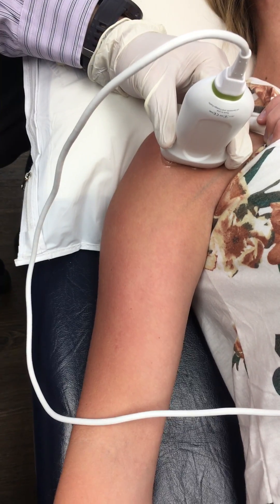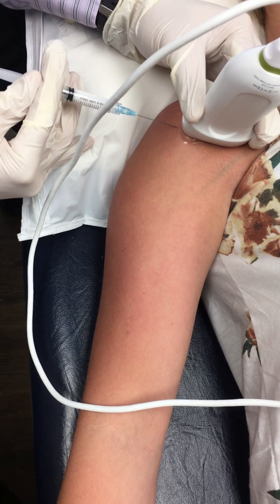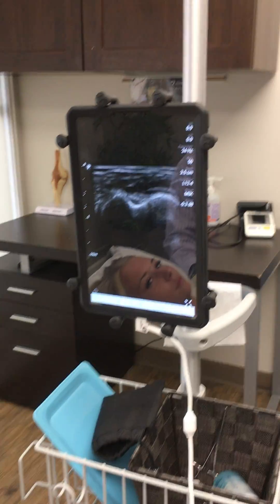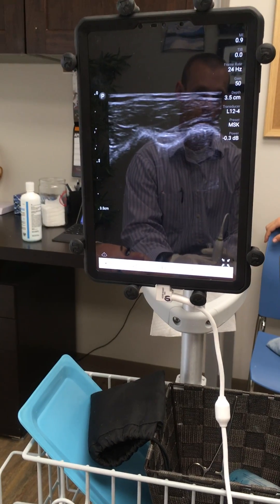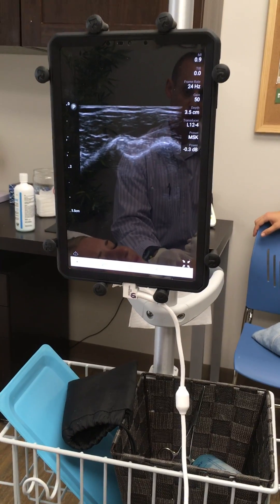Now I'm gonna turn your palm up just a hair like that — that's perfect. And now I'm gonna use some lidocaine mixed with some corticosteroid. I'm targeting — on the machine you can see my needle is just right to the transverse humeral ligament, just deep to that now. And I'm gonna inject, so I'm right next to the bicep tendon sheath.